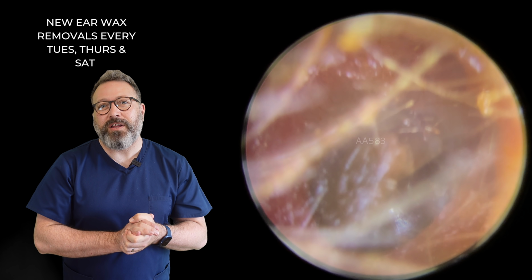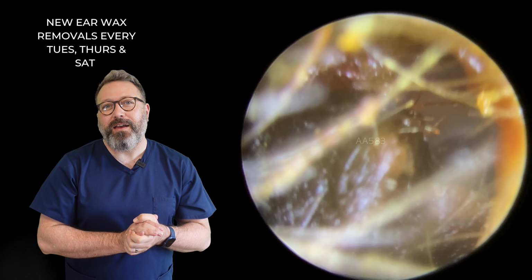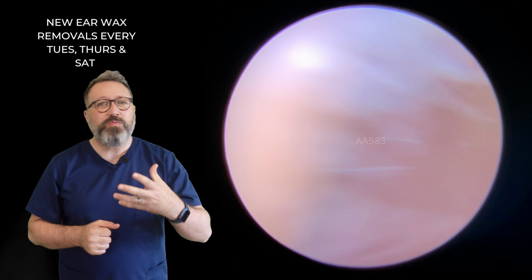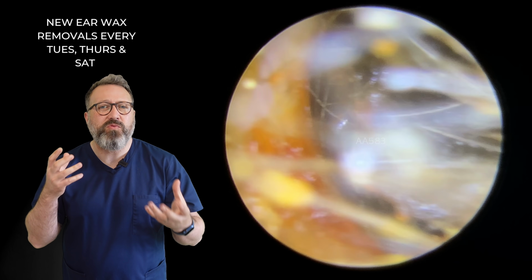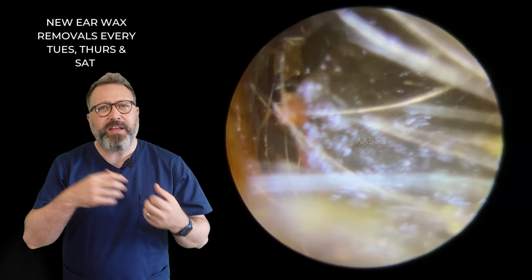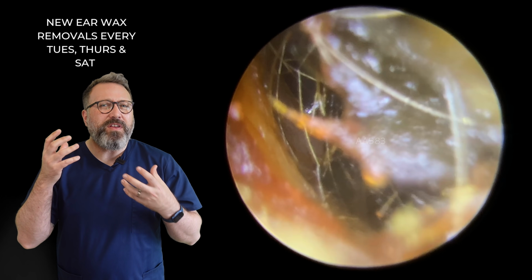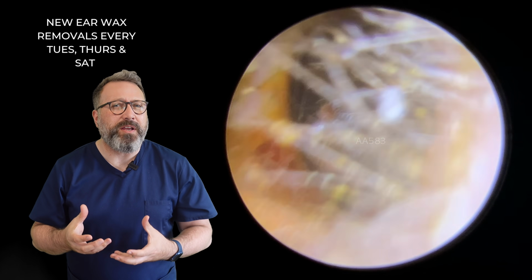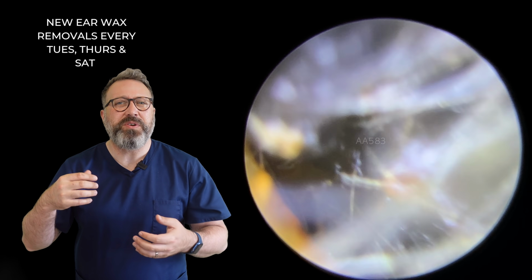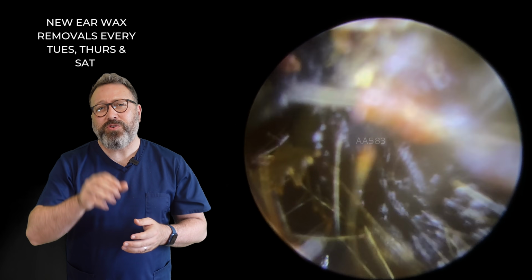So there we are. This is what it looked like at the start. And this is what it looks like now. So you can see a massive difference in that ear canal. The reason the patient wanted to get this done, they were finding their hearing was really, really intermittent. So when they were going to bed at night, they were finding when they sort of lay on their ears, they were feeling really, really blocked up when they woke up in the morning. And this was happening periodically. Whenever they bathed or showered, got some water in their ears, it was really uncomfortable. And that's all due to this wax.